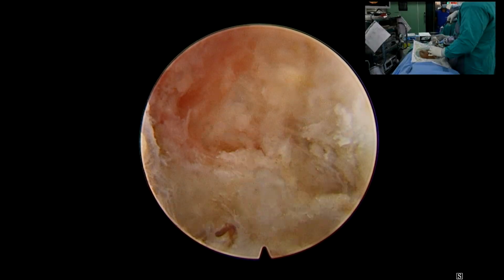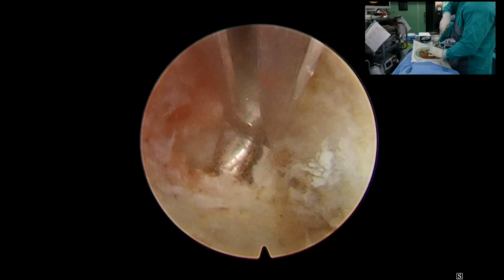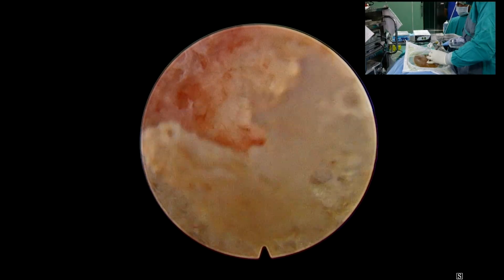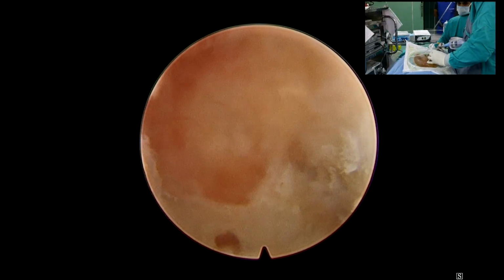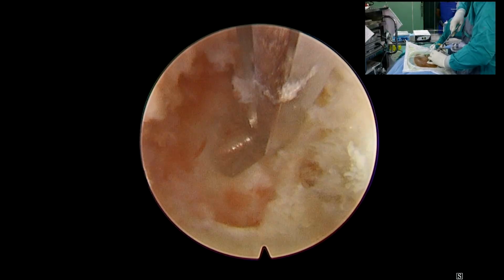It's the upper lamina that he's removing now. Yeah, upper side. He is cutting the upper lamina with the Kerrison and making the window wider.